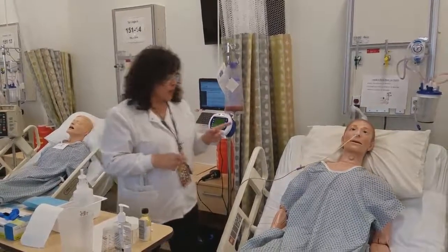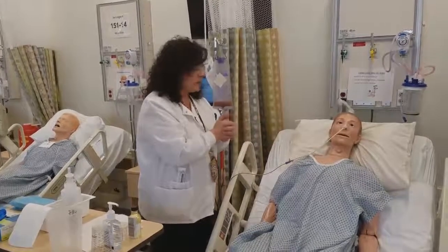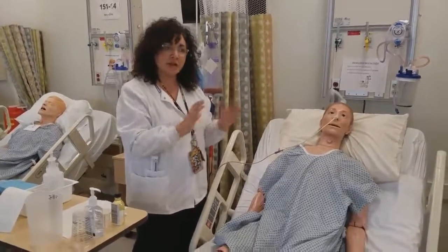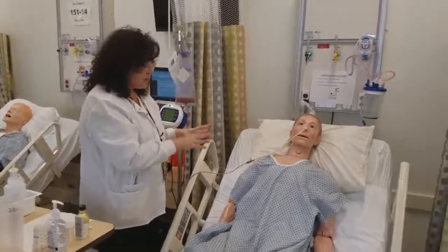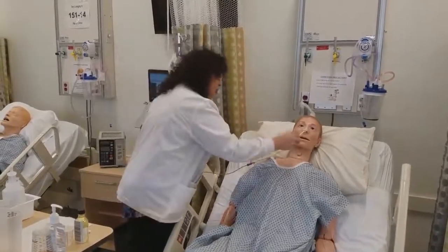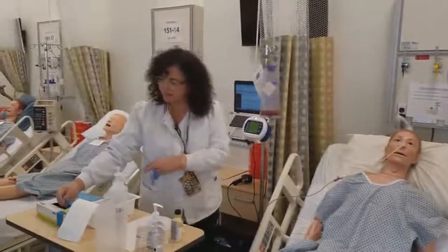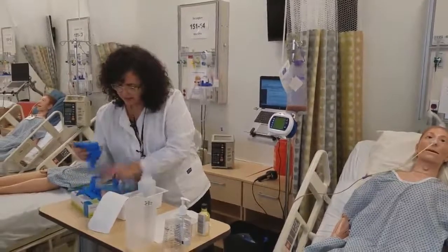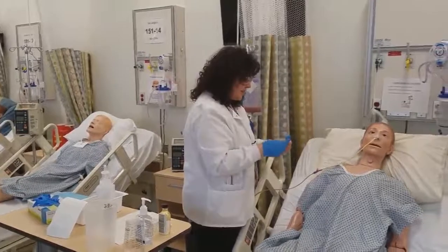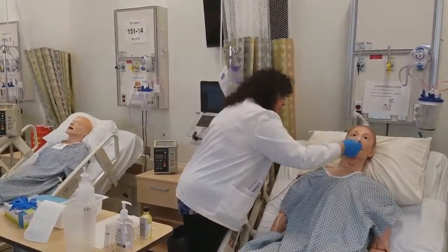So with tube feeding in progress like this, I do not have to worry about pH because the tube feeding formula buffers the pH, and that's not a valuable marker anymore in the presence of tube feeding. So what do I have left to work with? I'm looking at external appearance, so I'll go ahead and put some gloves on at this point. And I'll make sure that my marker is where I expect it to be based on my documentation. All right, that looks good.